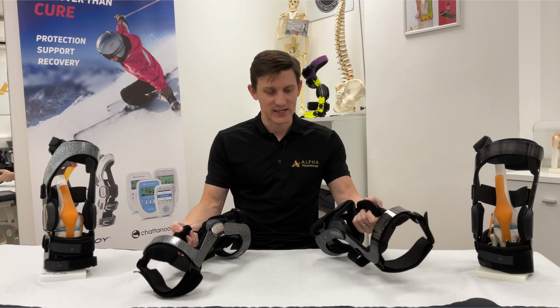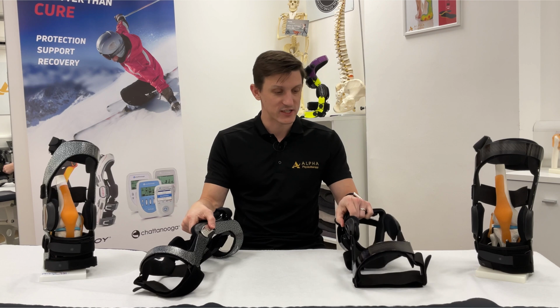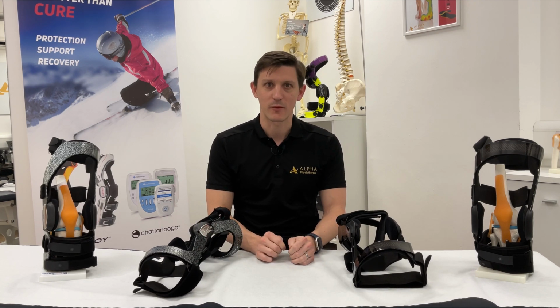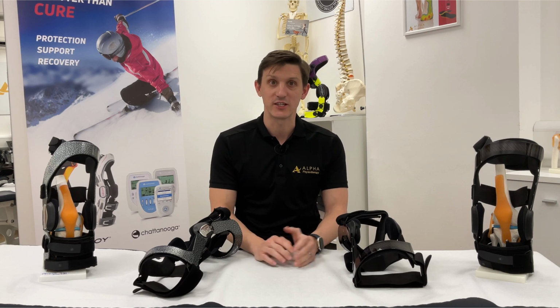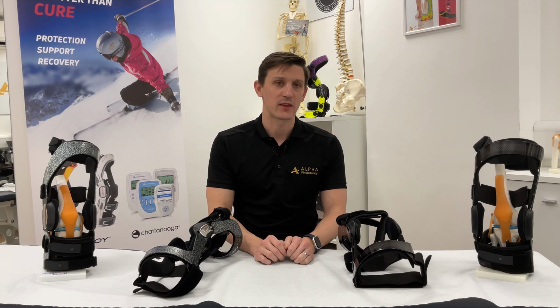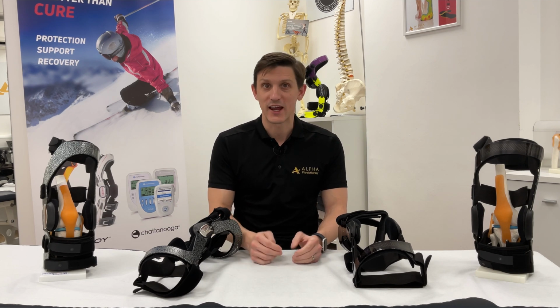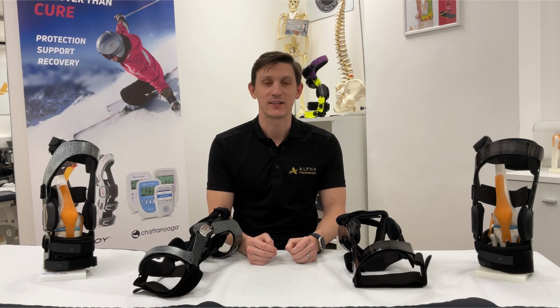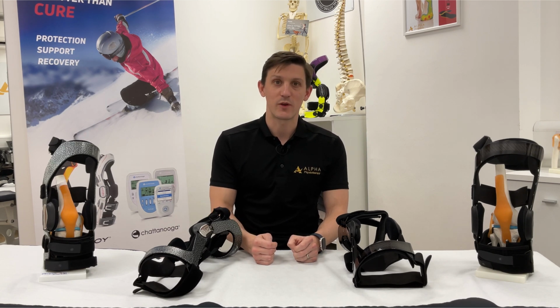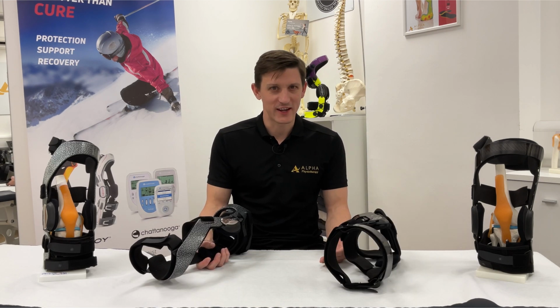Now, as I said, there's lots of different choices when making a decision as to wear a ski brace. But from my perspective, one of the most common things that we might want to look at is the underlying reason as to why we'd want to wear a ski brace. There's an inherent risk while skiing, due to the nature of the extreme sport that it is, that there's an increased chance of having a knee injury, and we may want to mitigate that by using a brace.